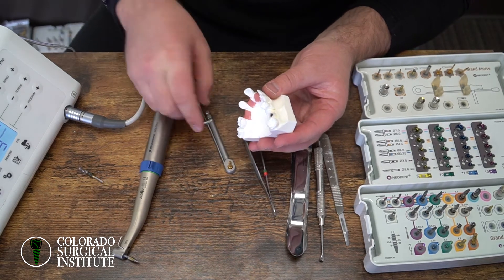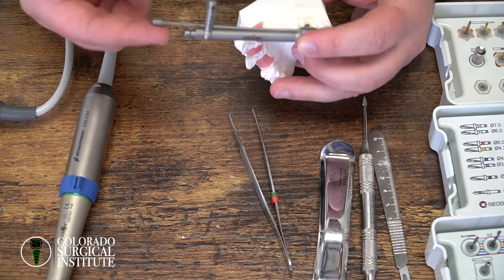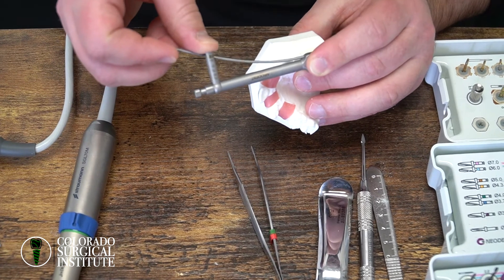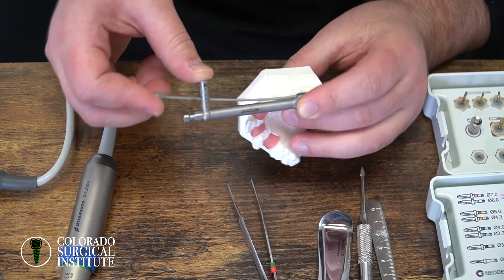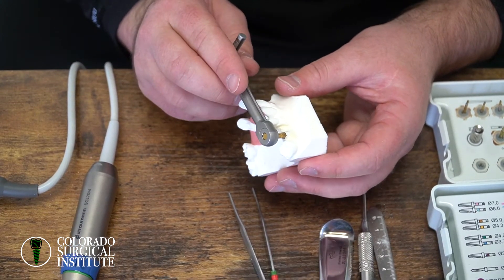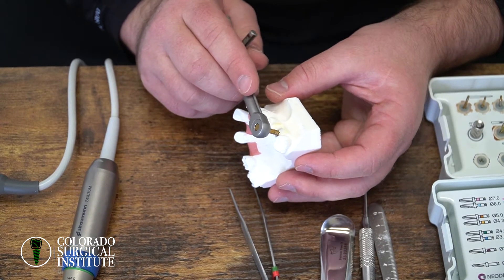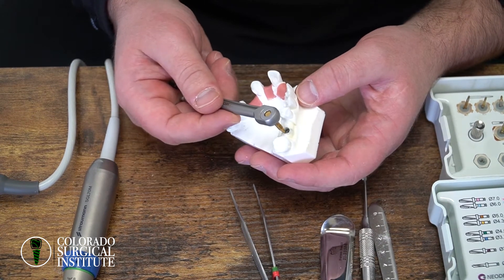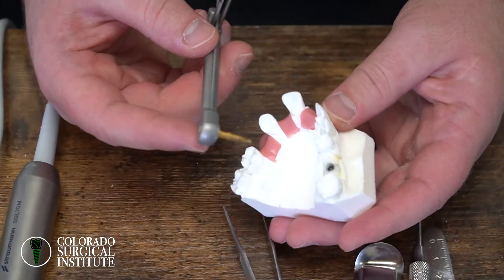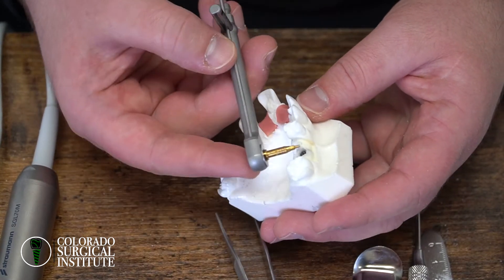Let's say you're putting the implant in and you're even with the cortex, then you put the torque wrench on and it's at 60 or 70 newton centimeters right on the cortex — that is a big no-no. In the beginning I would think, 'Thank god I got the implant in, it looks good, I'll cover it.' But cortex bone is very thick and doesn't offer a lot of blood supply, and that's when you end up with one millimeter of bone loss. Being even with the cortex is just not good enough.